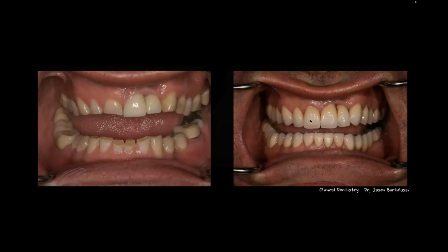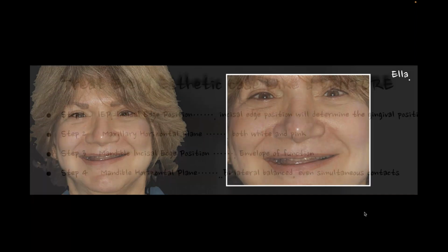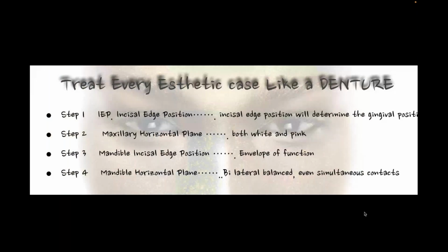So I want to make sure all the cases that I work through, as much as I think of them from the anterior, I'm really thinking them from the posterior, right? So if you look at Ella, and actually I just showed this case at Rutgers University last week, I'm thinking denture, where do the teeth belong in her face? How much longer do I want to make the incisal edge position? And then how am I going to handle that functionally in the posterior anatomy, right?